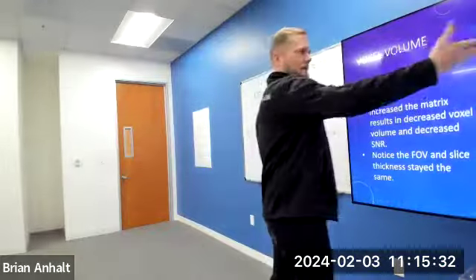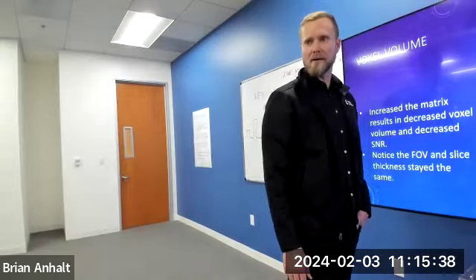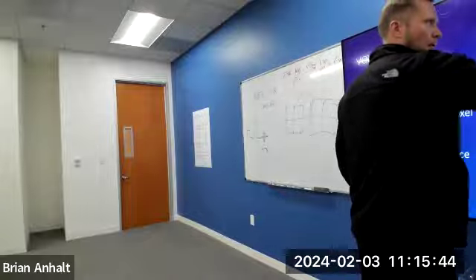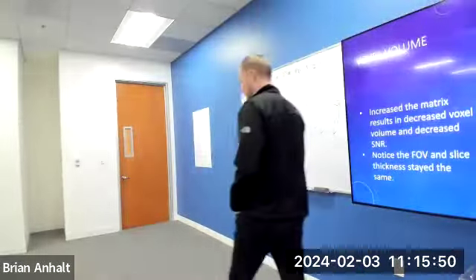Obviously, if we increase our matrix, we are decreasing the size of our voxel, right? Thus decreasing our SNR. If I double both matrices, if I went from 4x4 to 8x8, what happens to my SNR?